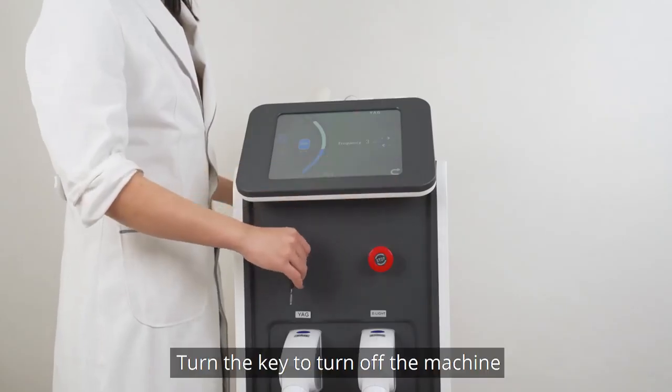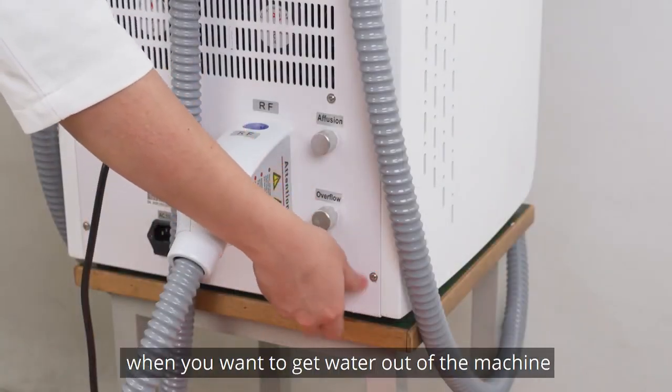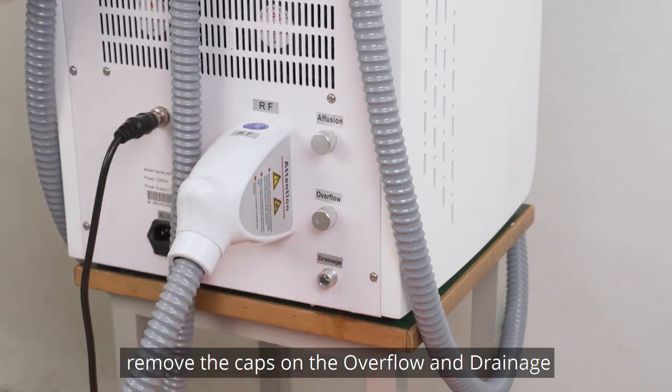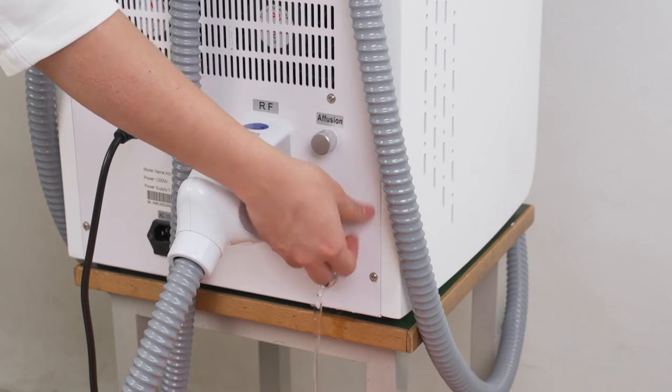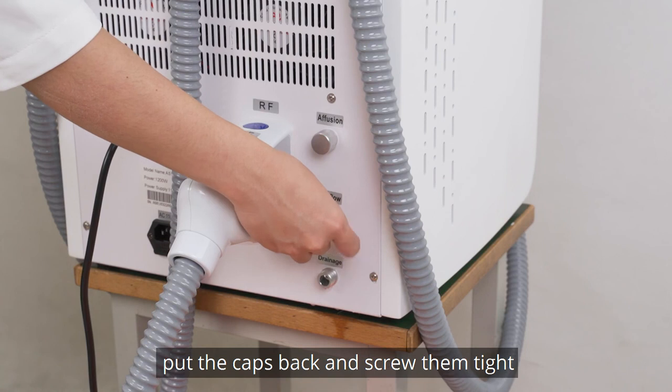Turn the key to turn off the machine. To empty water out of the machine, remove the caps on the overflow and drainage holes and water will automatically flow out. When the water is emptied, put the caps back and screw them tight.